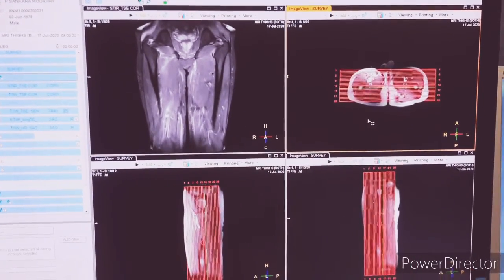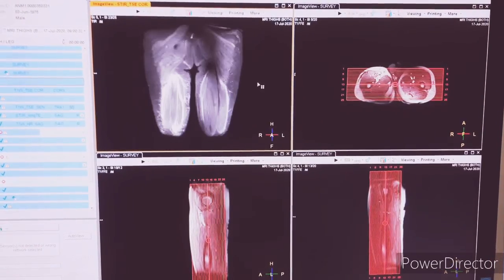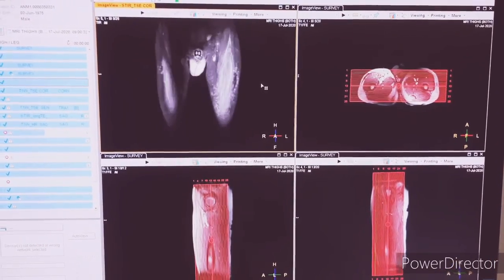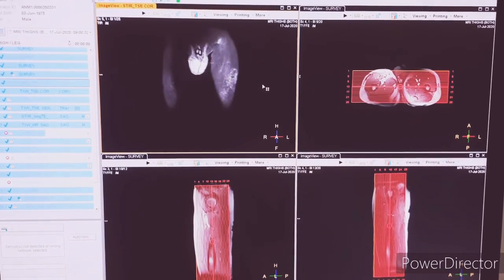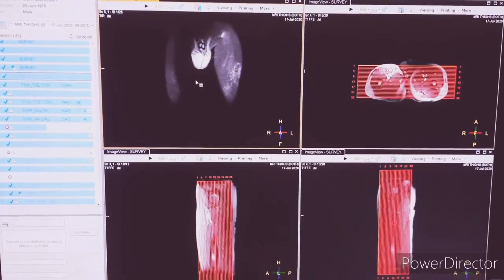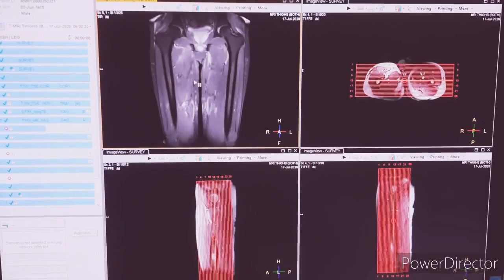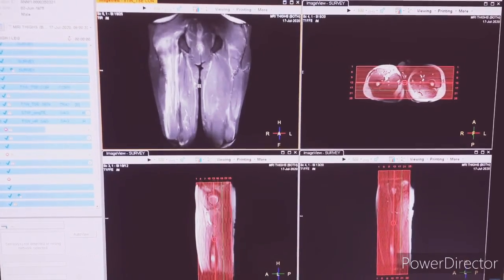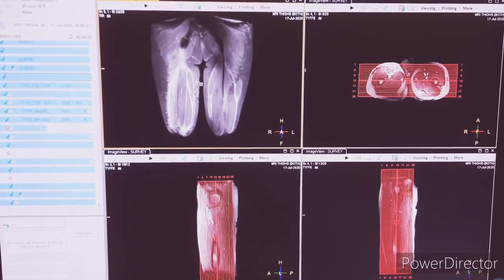You can see the planning here. Whenever you are taking long bones or a long body region, you have to acquire STIRCOR first. For STIRCOR and T1COR, don't forget to place a marker wherever the patient has pain or wherever you have the region of interest.